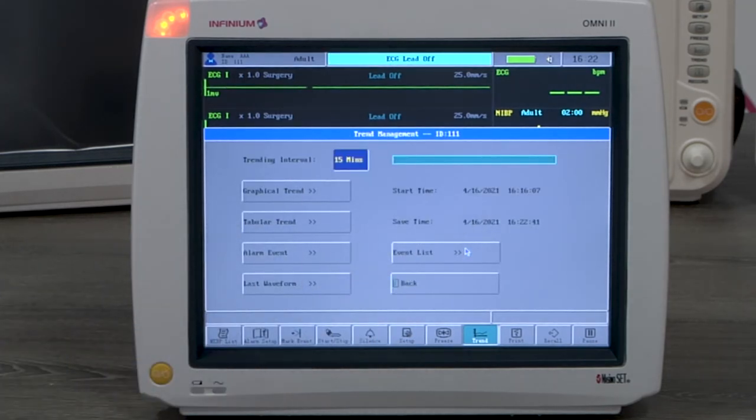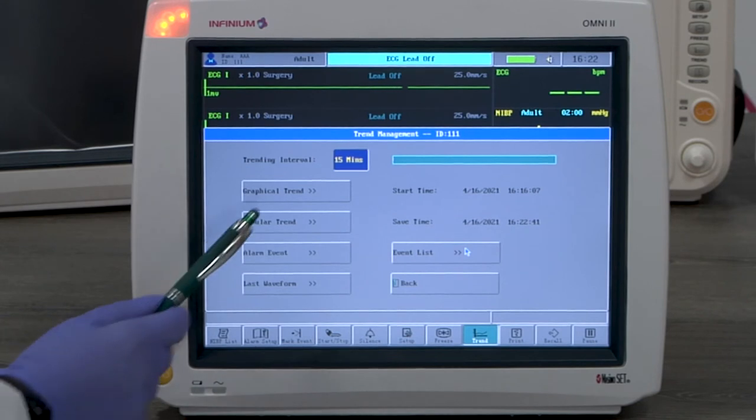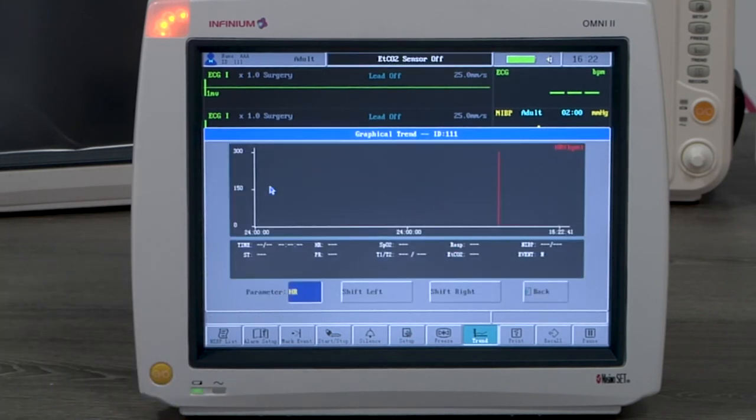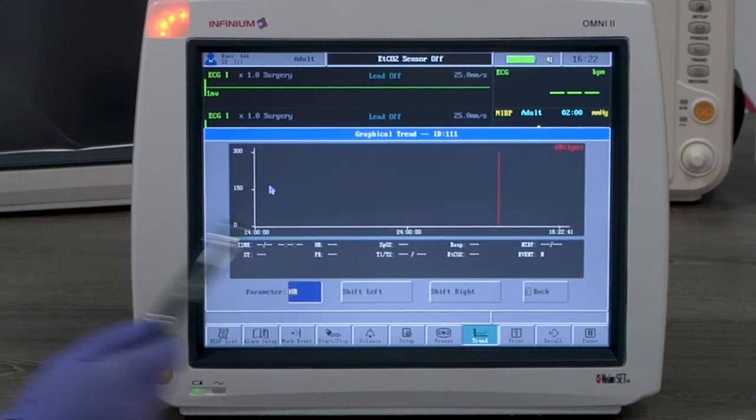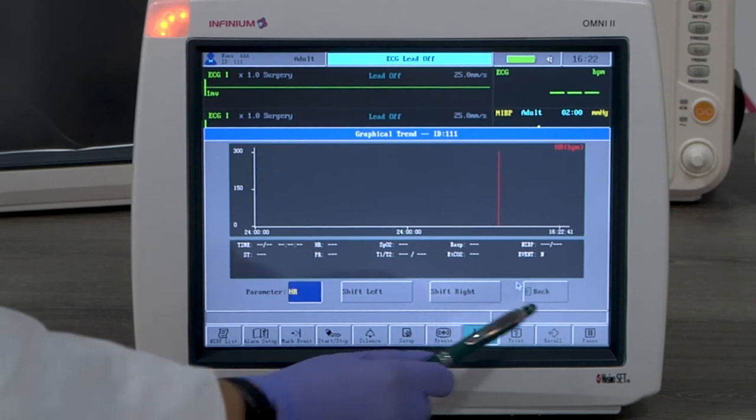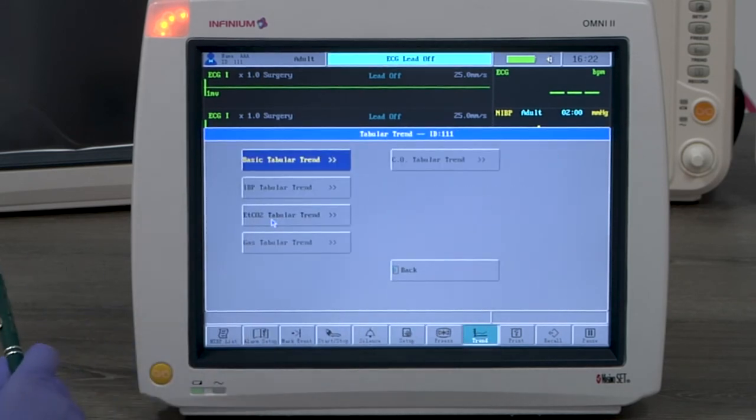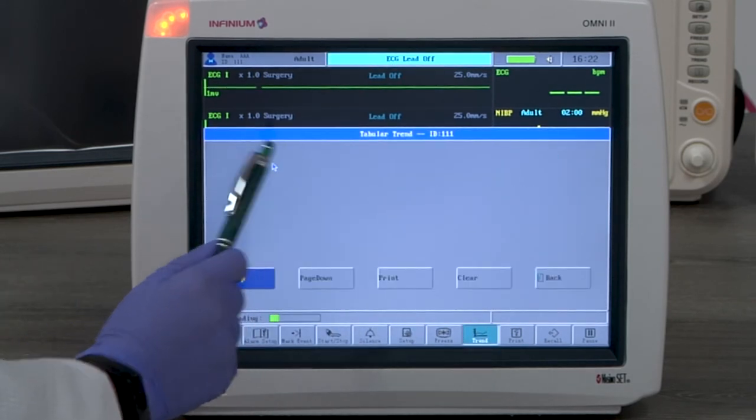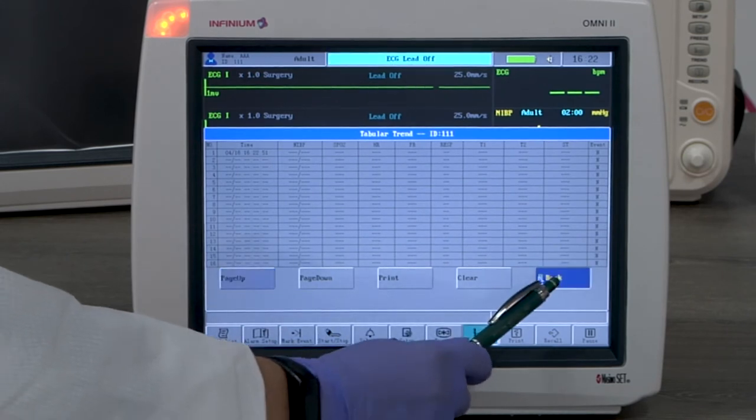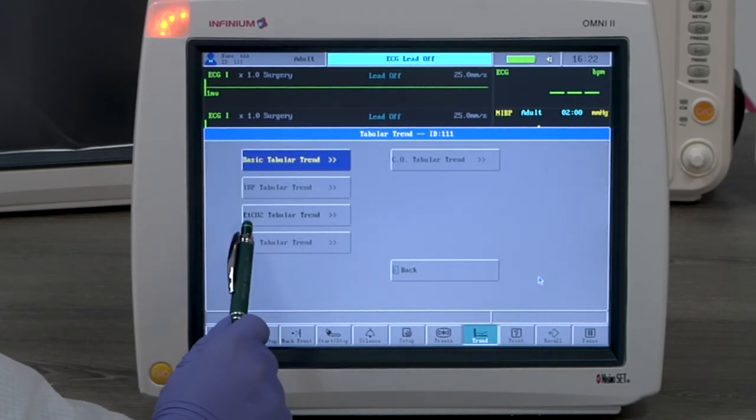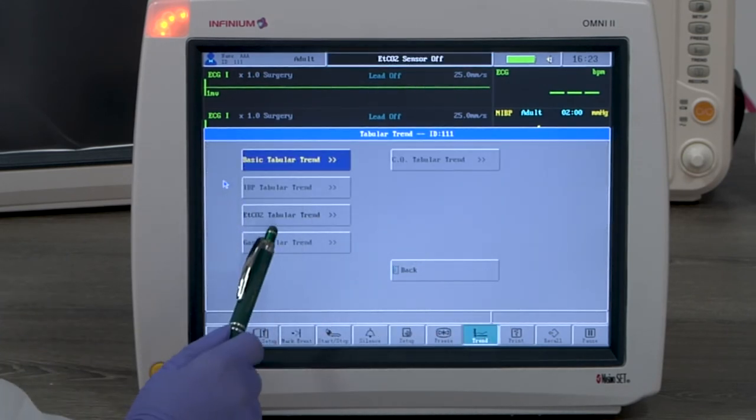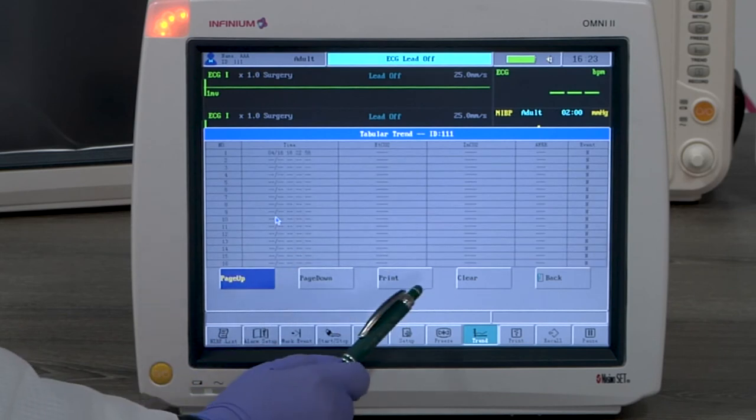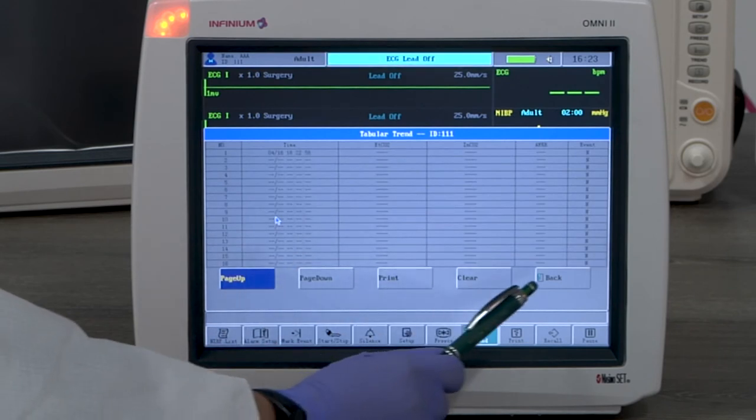Graphical trend shows the readings of the selected parameter in a graphical form. Tabular trend shows parameter readings in a table. Basic tabular trend includes all standard parameters. Optional parameters will be in their individual trend table. The print button will print out the trend table data.